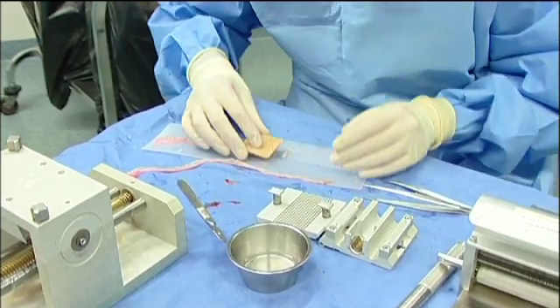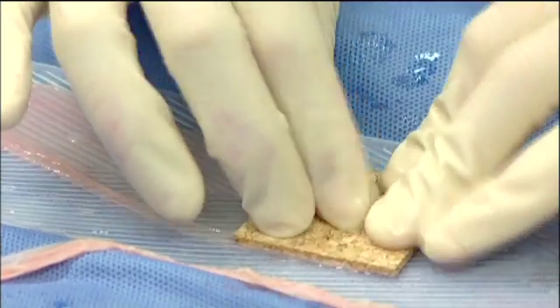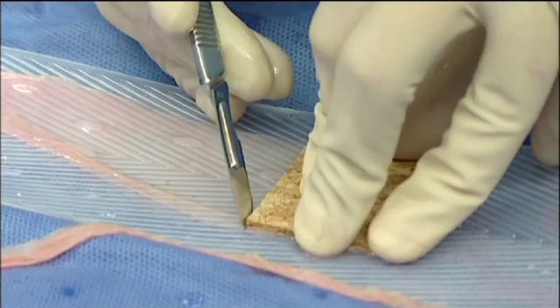Furthermore, this dermatome is often used to harvest the 42mm or 1.65 inch wide graft that's required in Humica's MEEK technique.